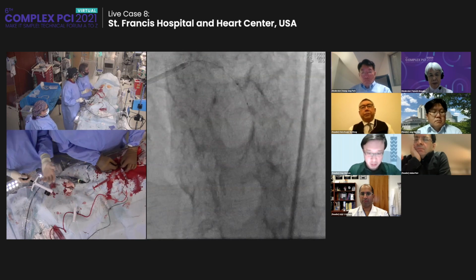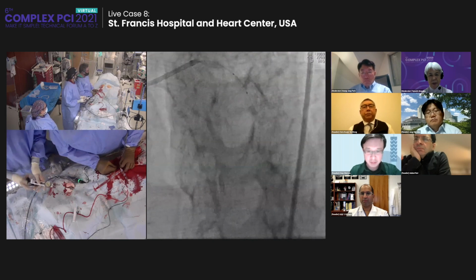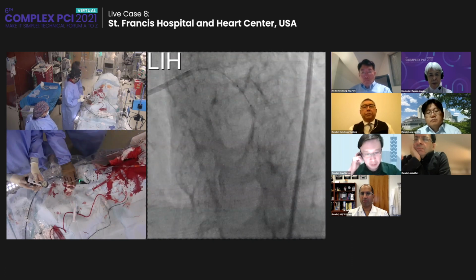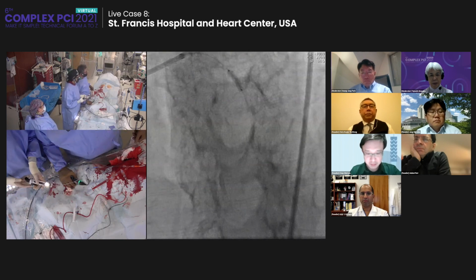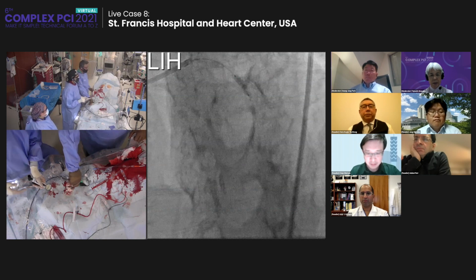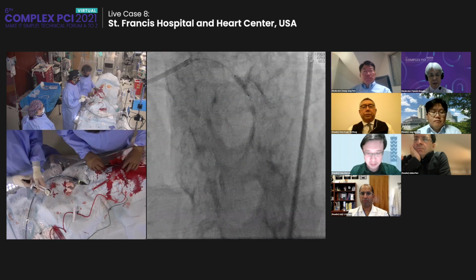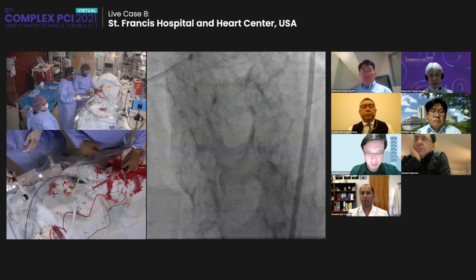I think we have enough here. Do you want to just do one in the middle across that section? Okay. So the question is, when do you know you're done? The balloon is completely yielding. You can see it looks good everywhere. We're just going to go and re-OCT. Just like a TAVR, we have all of our equipment here already. So we're going to get our stent prepped.